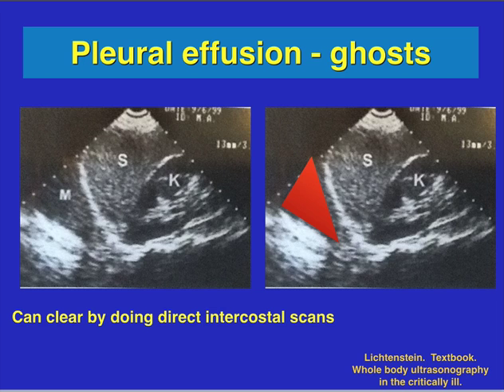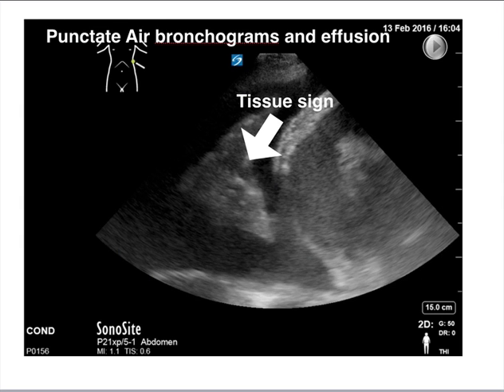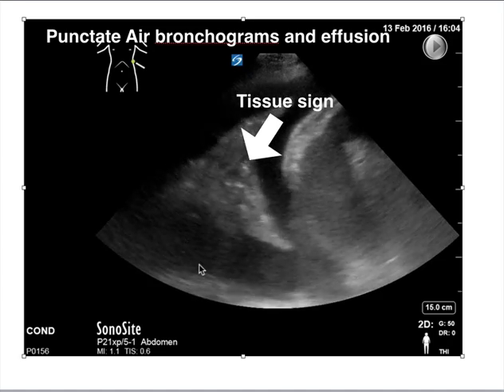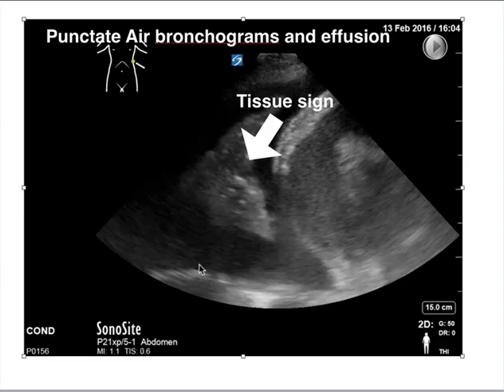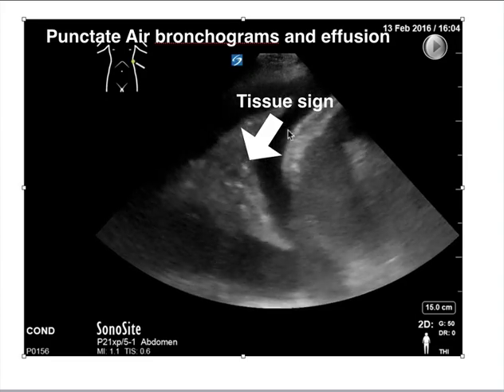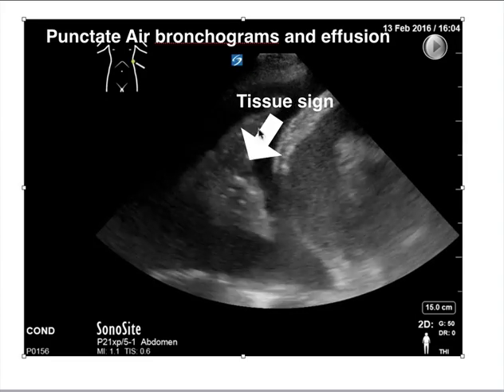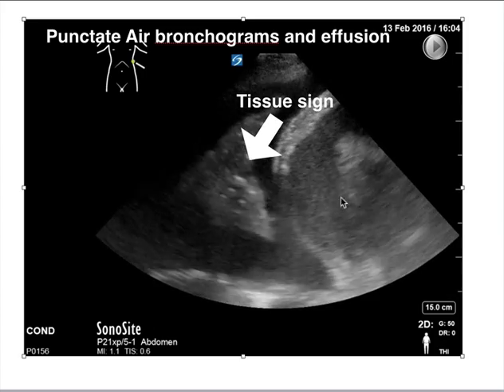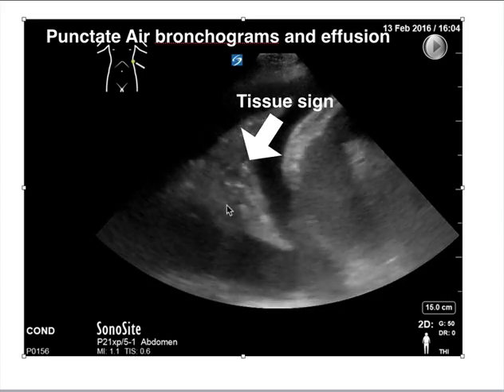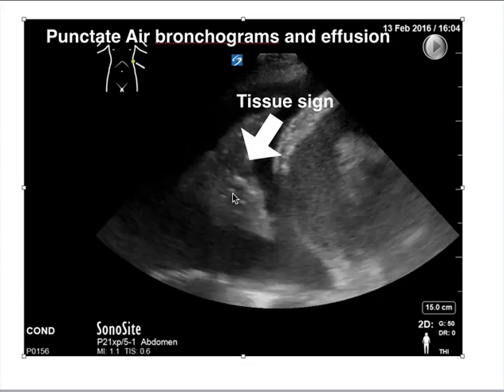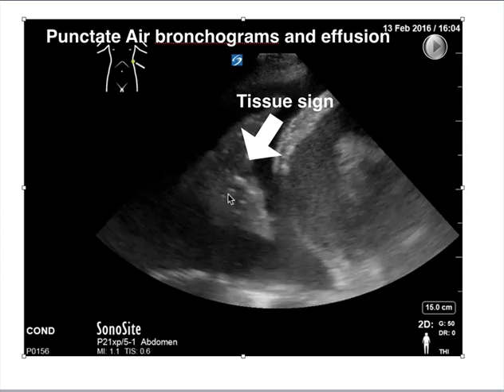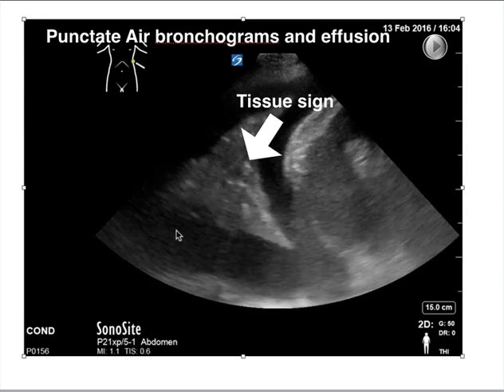The next few slides show various images of pneumonias. Here are punctate air bronchograms with an effusion. You can see a large pleural effusion with fluid both below and above. This is actually the lung, this is the diaphragm, and this is the liver or spleen. Within the consolidated lung, you can see bright hyperechoic structures — those are punctate air bronchograms and can indicate early pneumonia.